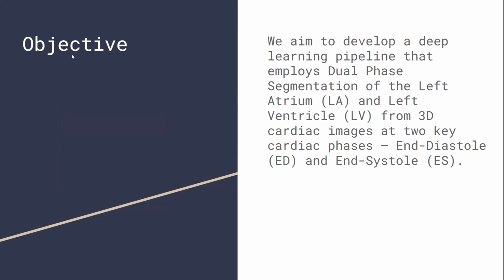Our objective, or problem statement, is that we aim to develop a deep learning pipeline that employs dual phase segmentation of the left ventricle and left atrium from 3D cardiac images at two key cardiac phases, which are end diastole and end systole.